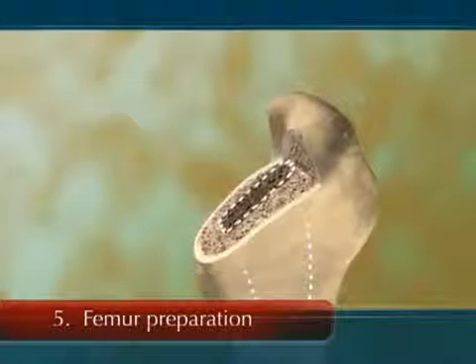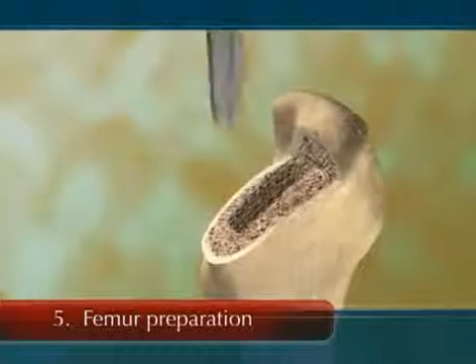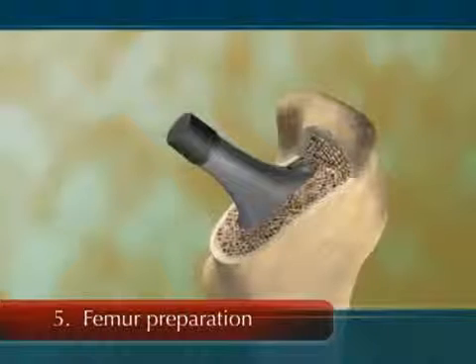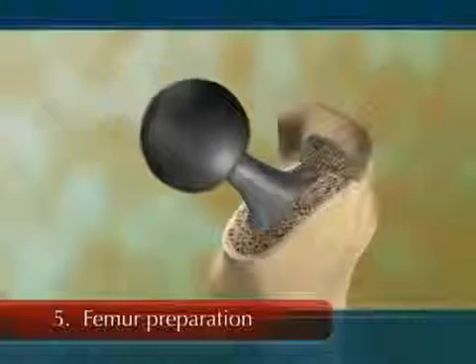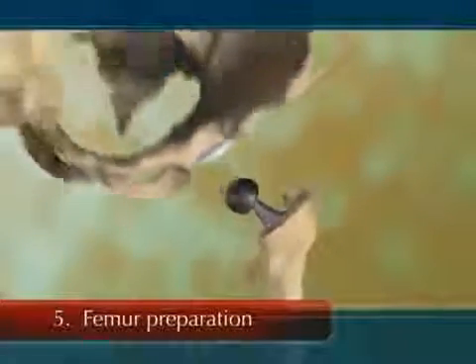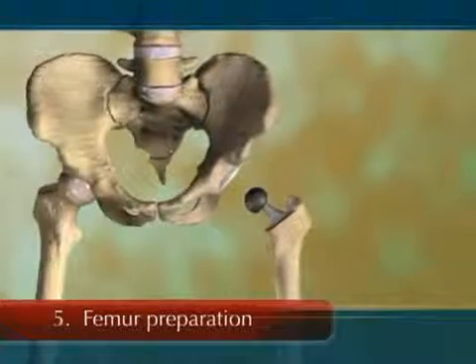The inside of the femur, or thigh bone, is then cleared with various types of devices, and a prosthesis is placed into the femur. A trial ball is placed on the top of the femoral stem, and a plastic insert is placed into the cup.